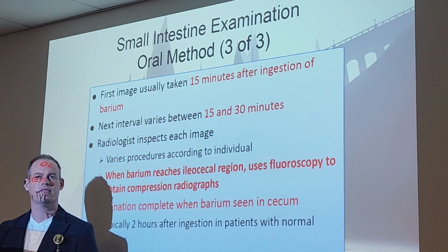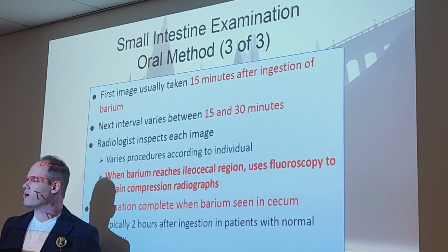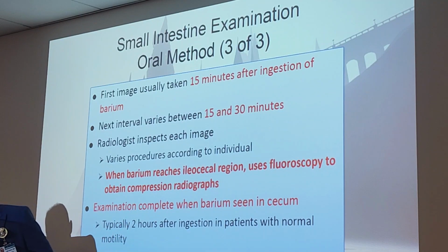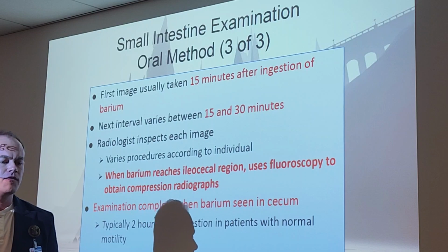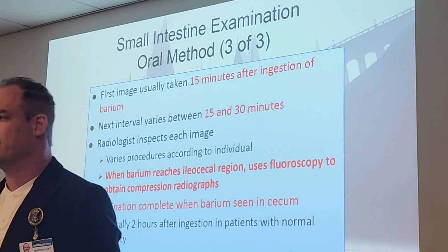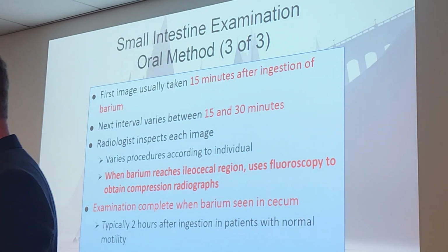Okay, so typically, on average, we're going to take that first image after the scout, by the way, and they've drunk the solution, 15 minutes after ingestion of barium. Very important number to remember there, guys. Big star on that. Your next interval will vary between 15 and 30 minutes on average. Let's say on average because your doctor makes that decision for you. They might tell you to do it an hour from then. You never know what they're going to say to you. But on average, 15 to 30 minutes.